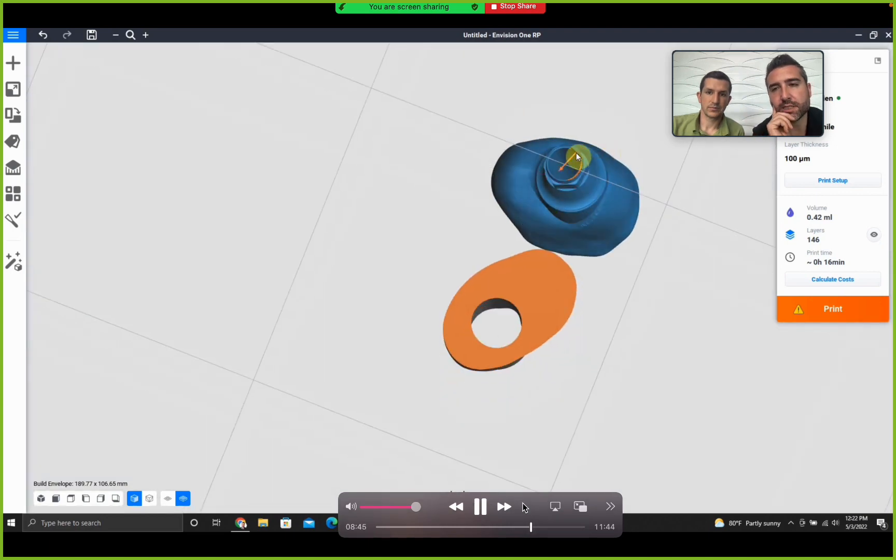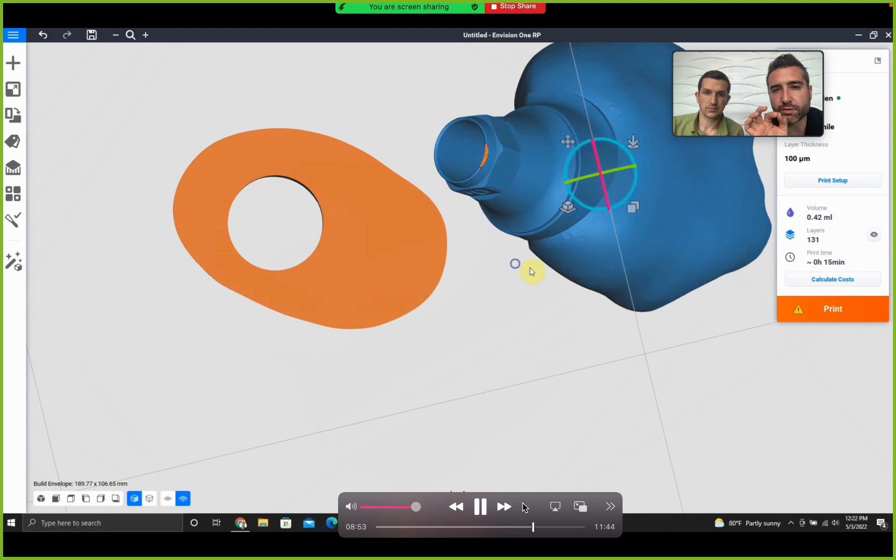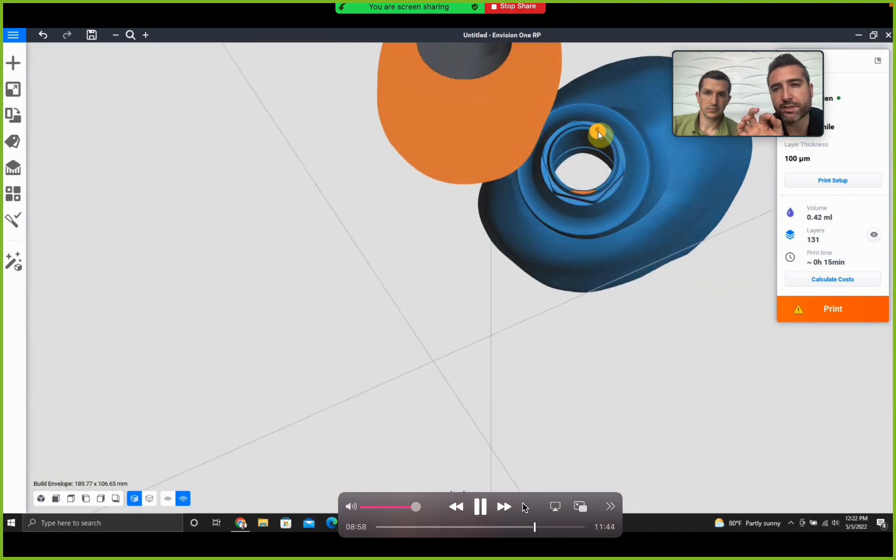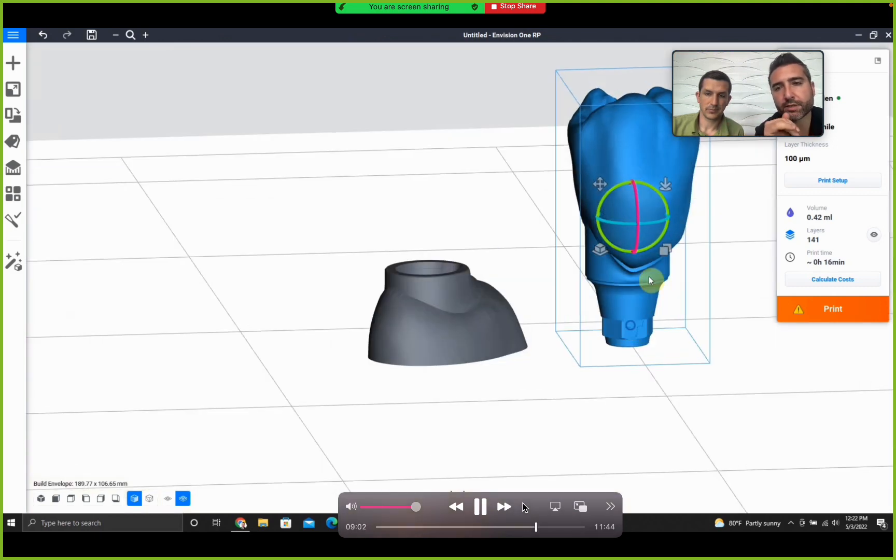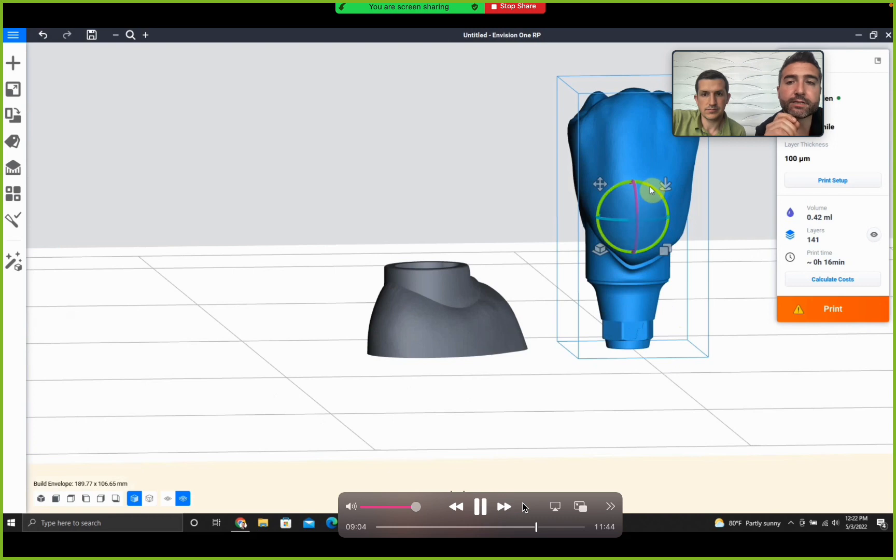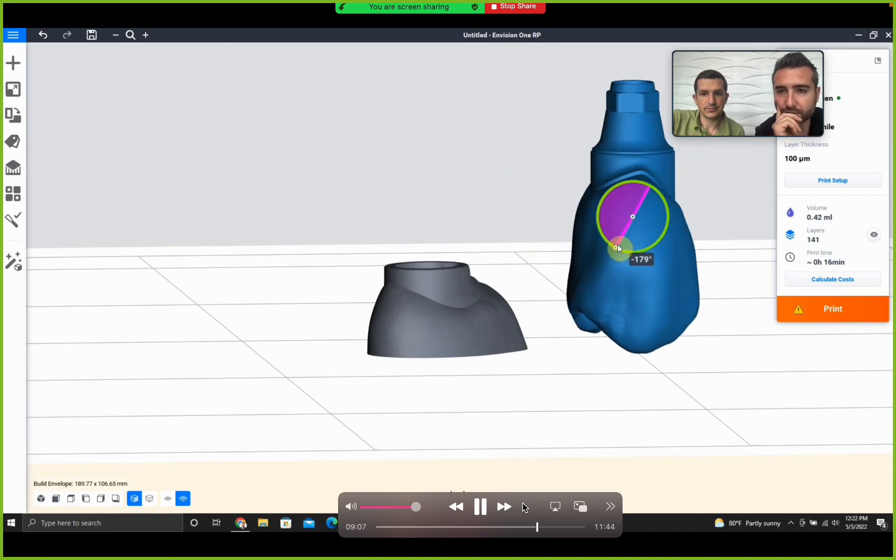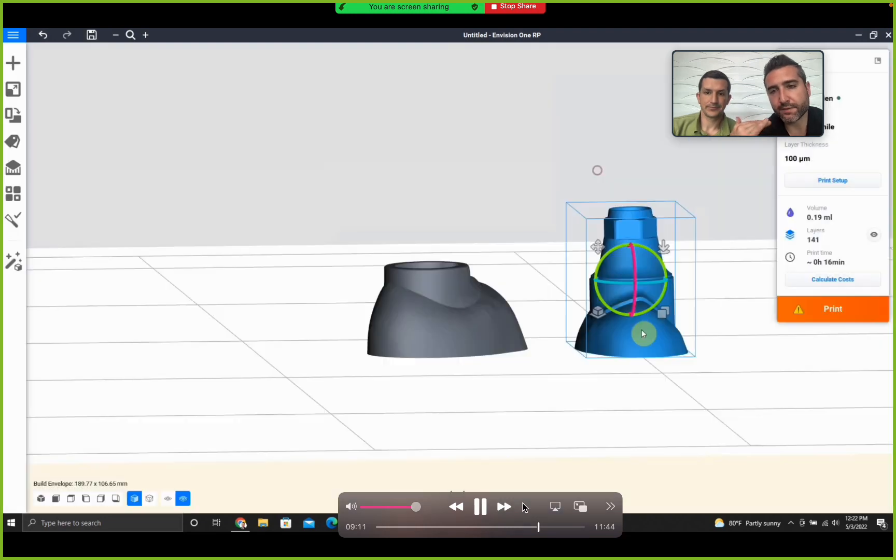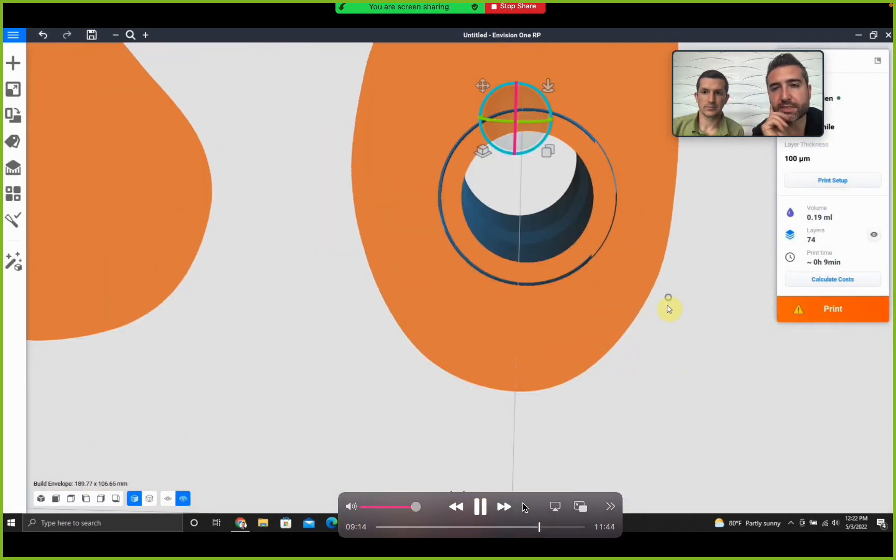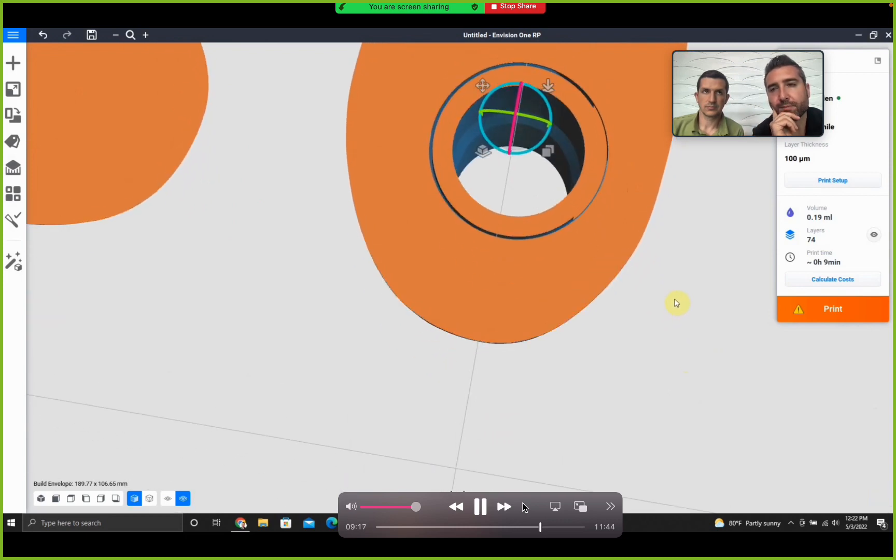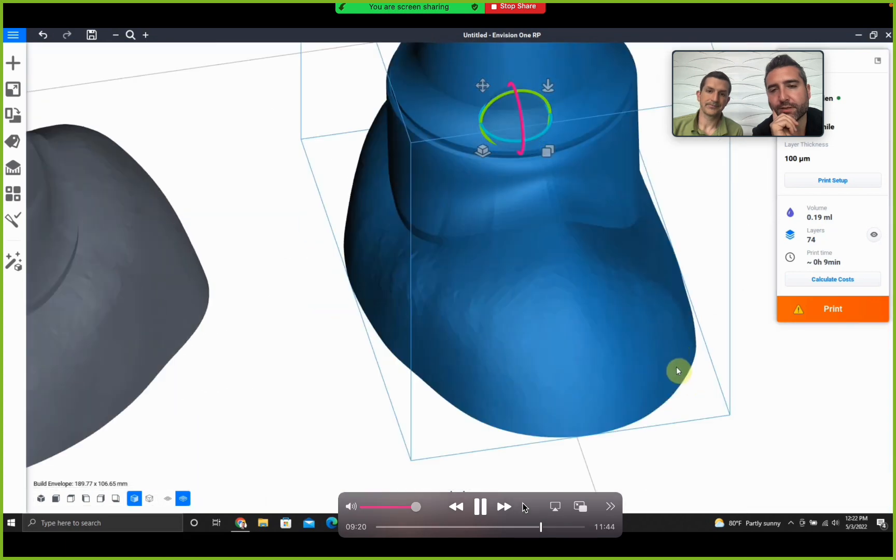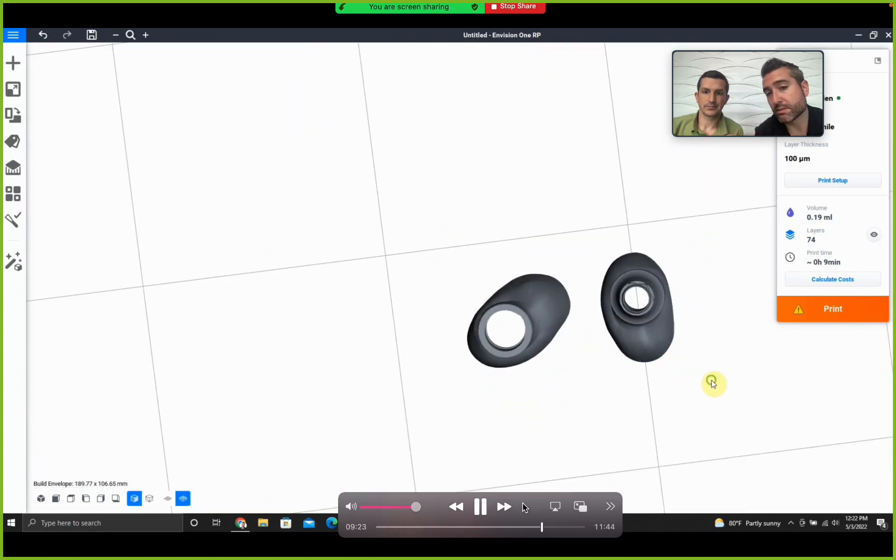Then use the feature to slice it and print flat on the build platform. Same with the integrated hex for direct to fixture - let the software find that hard edge. You want it orange all the way around circumferentially, flat against the build platform. Flip it 180 degrees, then use the integrated slicer plain cut feature to plain cut it. This will print in nine minutes. Don't worry about the separation of meshes - it'll print fine. So you have these two options: titanium tie base or direct to fixture.